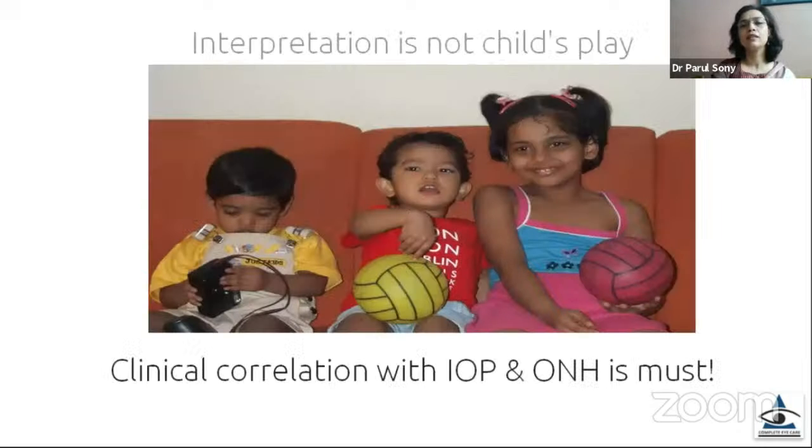And at the end, the interpretation of visual field is not a child's play. We should always correlate it clinically, compare it with the optic nerve head findings and the OCT and the intraocular pressure to make a complete diagnosis.